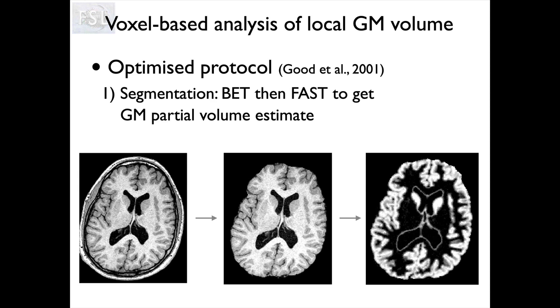In terms of the things that we run through, I'm going to explain how the pipeline works so that you have an idea of the different stages that it goes through. You can understand the outputs that you'll be seeing when you actually run this process, and also understand some of the things that need to be done to your image so that you know what kind of images are reasonable to process.